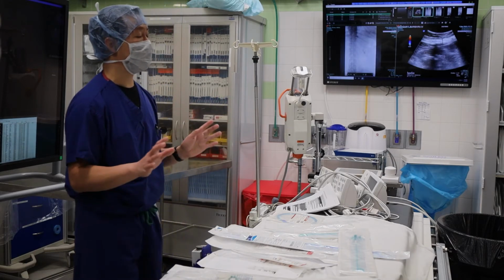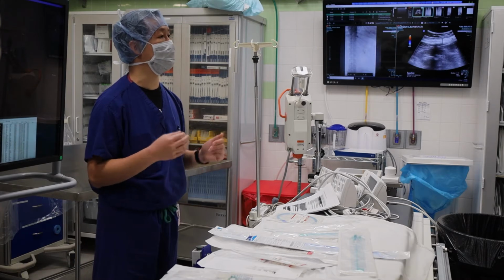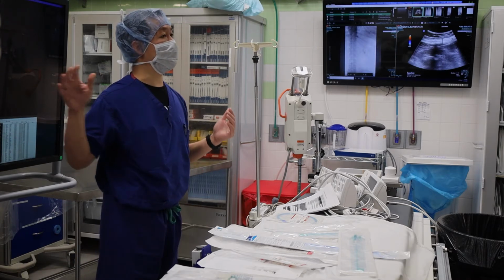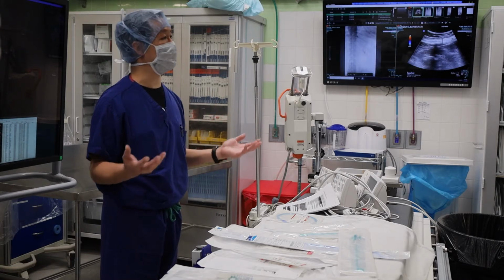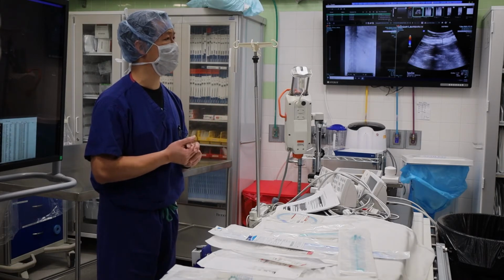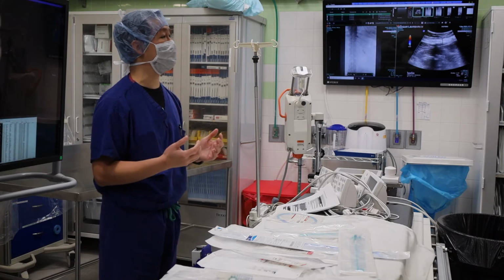Slightly rarer than the typical perc nephs, and then we'll ask for those when the time comes. But you should always think about them depending on the case that we're doing, so that you have an idea if the doc gets asked for it, where to get them. Okay. Do you guys know where to get those wires? Does anybody not know where all those wires that we just named are listed?